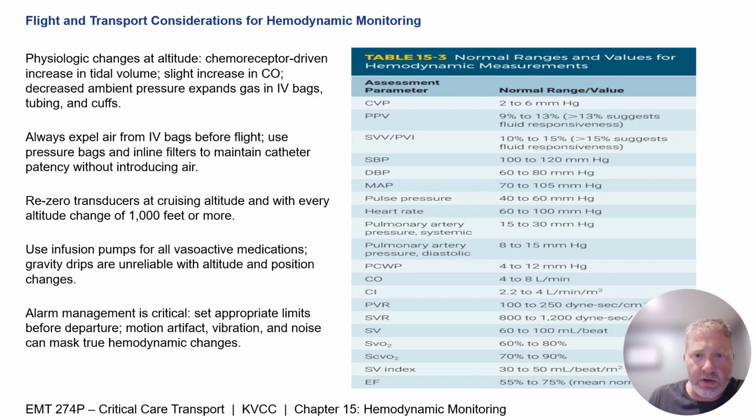Noise makes auscultation and troubleshooting a lot more difficult. The transducers, say on an art line, can shift out of position during loading or flight. Infusion pumps may behave differently than gravity systems under movement.